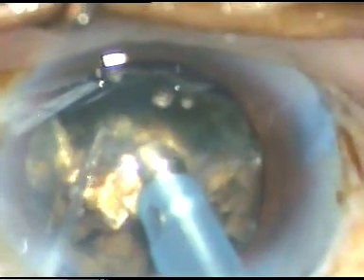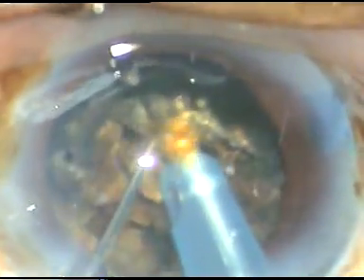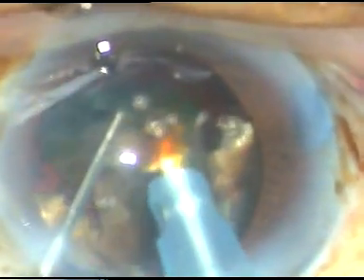In other machines I have used, I had to frequently manually clear the tubings by syringe — pushing BSS. But in this machine, surprisingly the tip doesn't get blocked, probably because it gets emulsified inside. Now this is the other hemi-nucleus which has been divided into two parts with the help of phaco energy. The two parts were attached near the center of the nucleus. I just tilted that part and applied phaco energy where the two parts were joined — and it gave in.